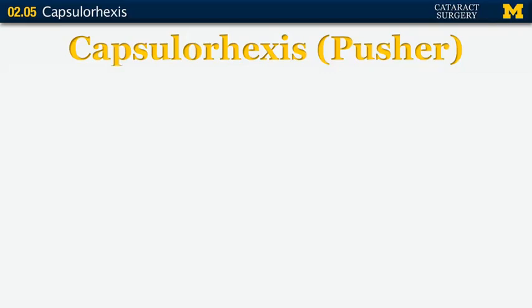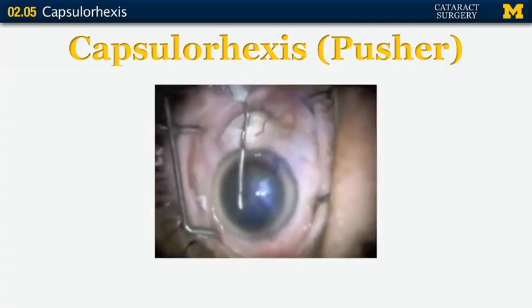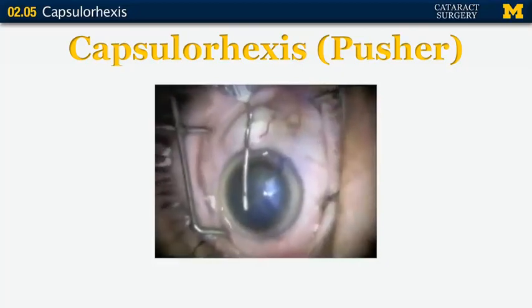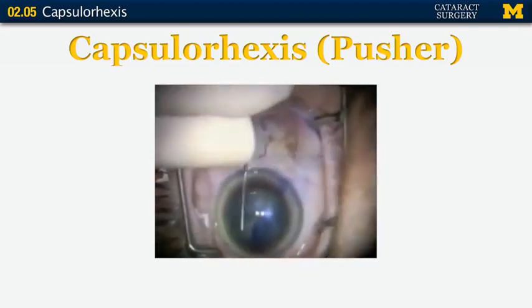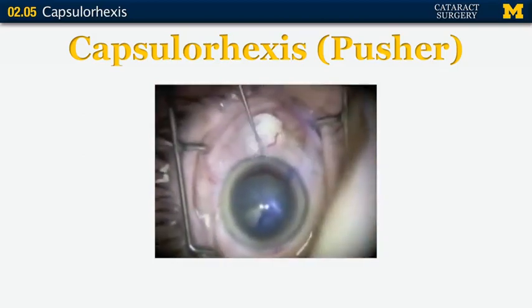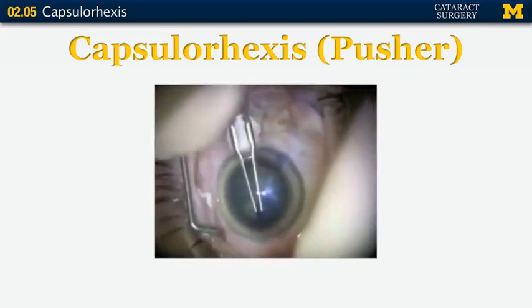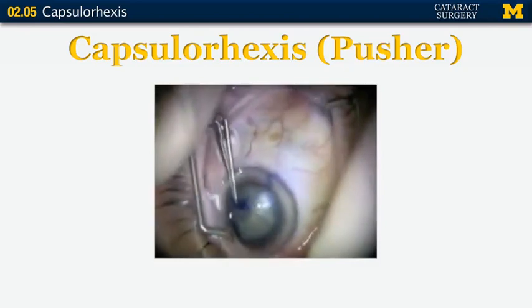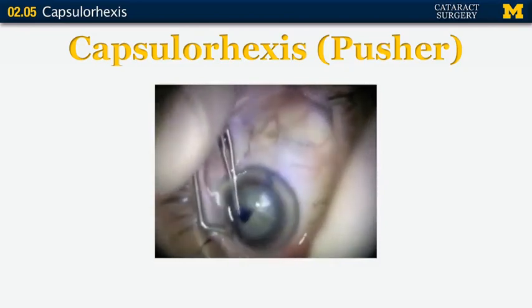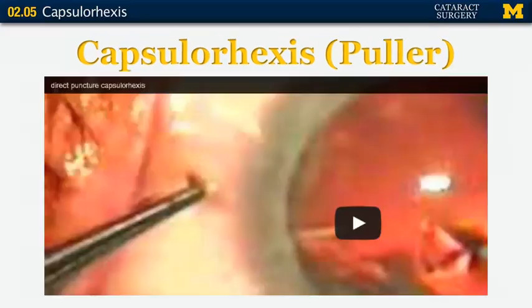Just think of the capsule as being like cellophane — if there's an irregularity, it's more likely to tear. Now let's watch a video of someone who is a pusher: they use a cystotome to push up a flap in a patient with a very dense white cataract who needed trypan blue staining. You can never have too much viscoelastic. After pushing up a flap, they use Utrata forceps to fashion the continuous curvilinear tear. I needed to re-grab right there, and should have done it sooner, but fortunately it remained a continuous curvilinear tear.